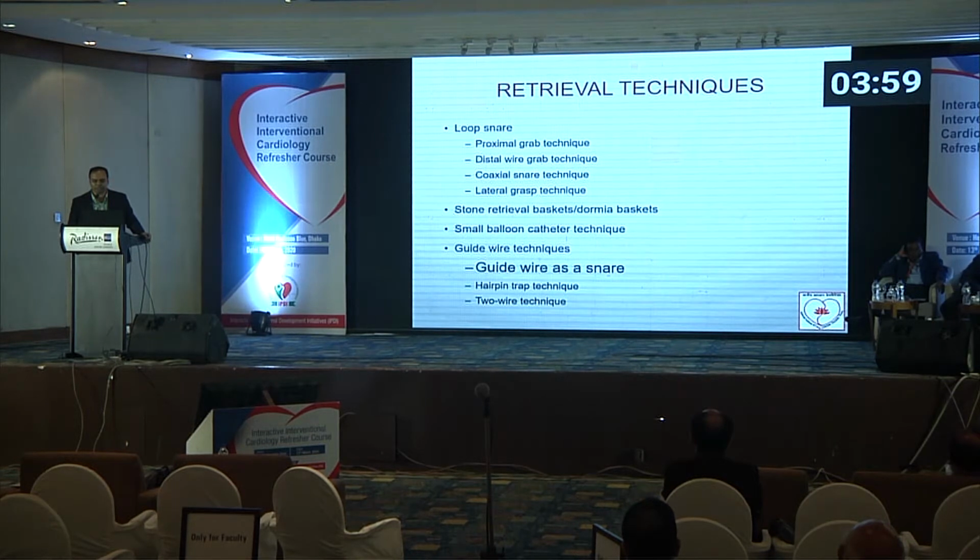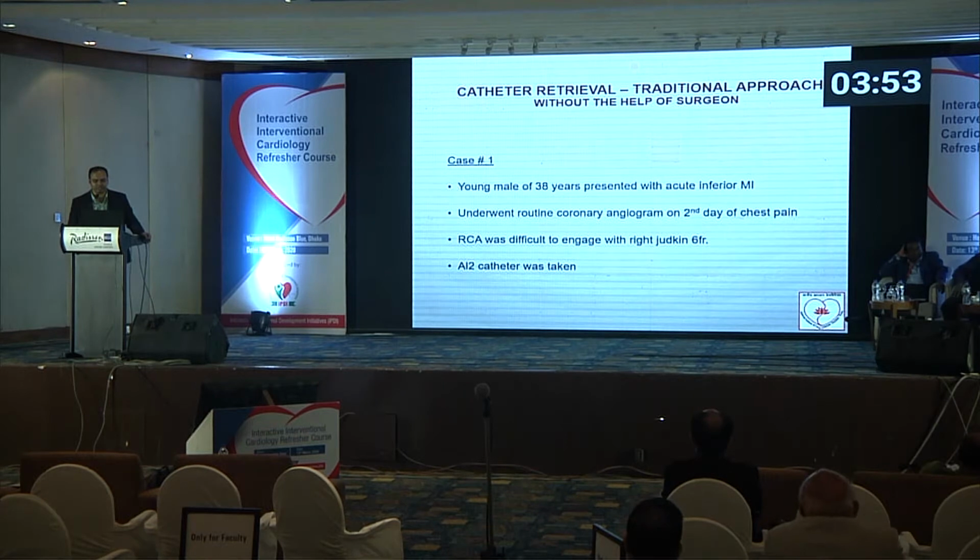There are different retrieval techniques. I am not going into the details; I will share some practical experiences. This is case 1: a young male of 38 years presented with acute inferior MI, and the RCA was difficult to engage with a right Judkins 6 French catheter.